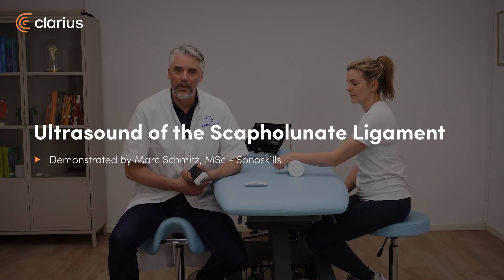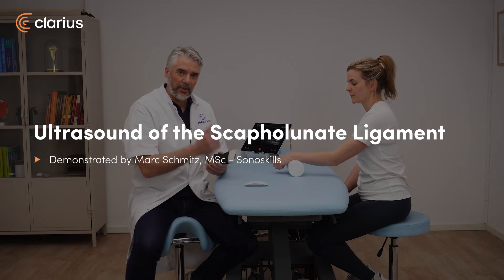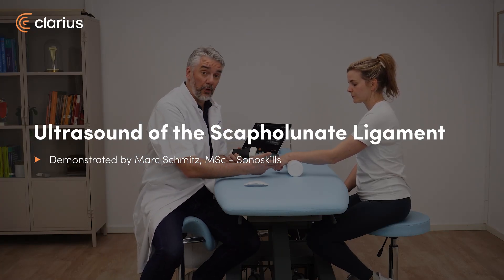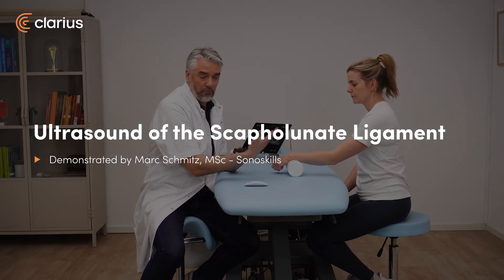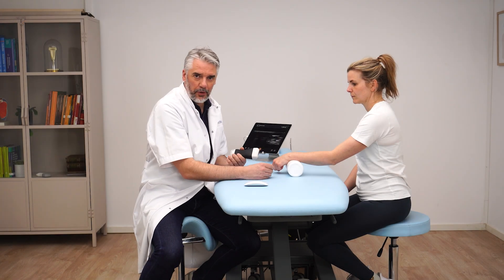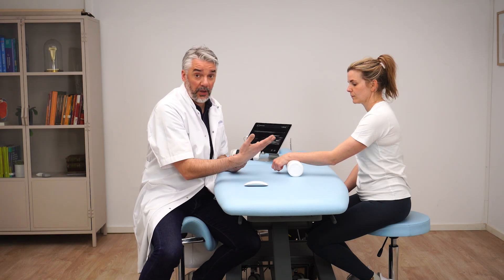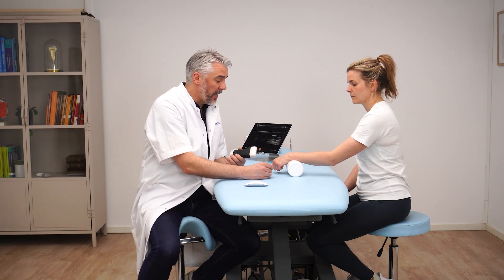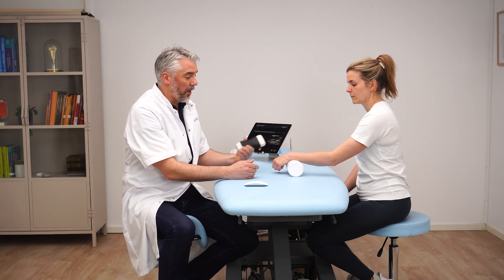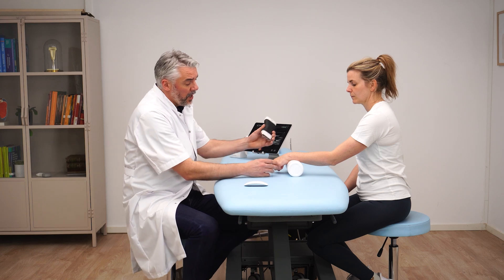To scan the scapholunate ligament, the patient is seated and the hand is placed over a gel bottle, a bolster, or something like a towel, so the hand is in a relative palmar flexion.